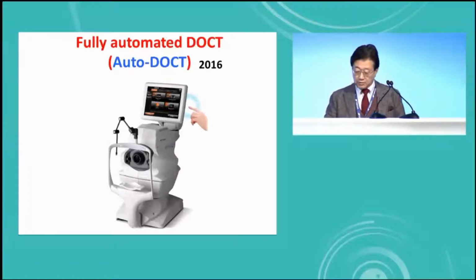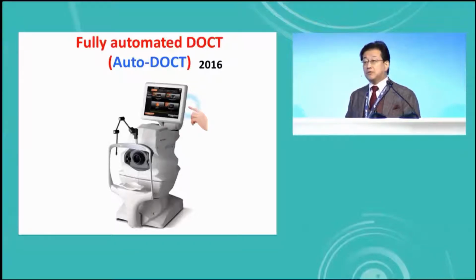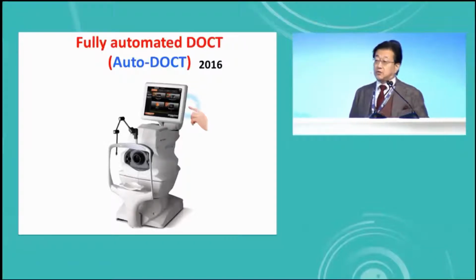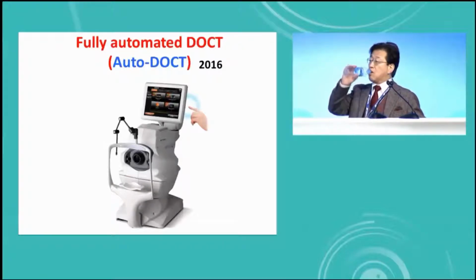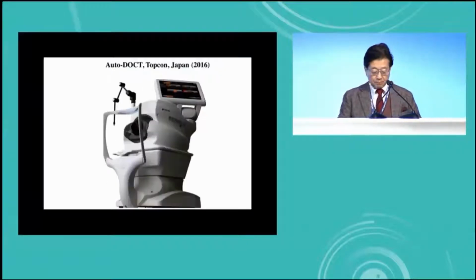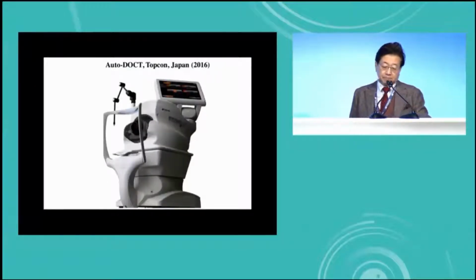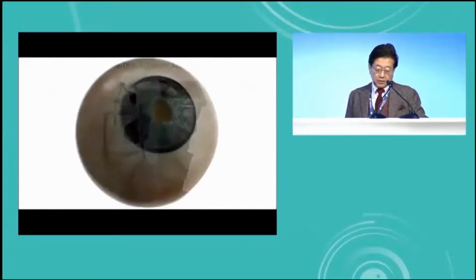So I'm going to show you with a video how easy it is to get the absolute retinal blood flow. This is the one. This is Topcon based. Everything is auto.